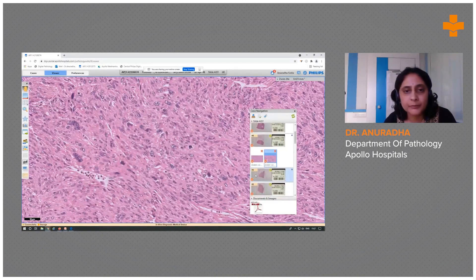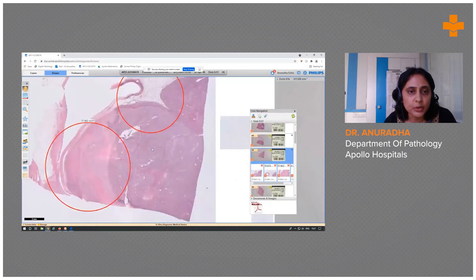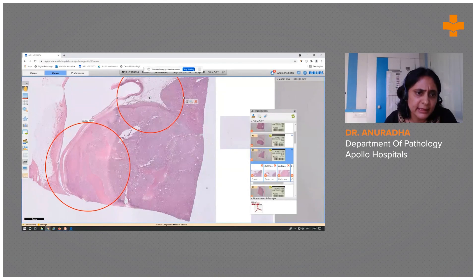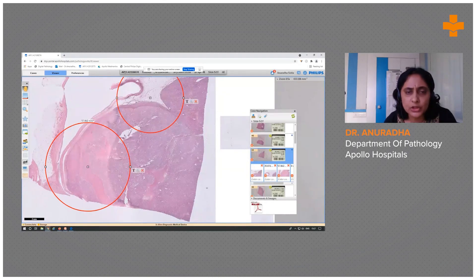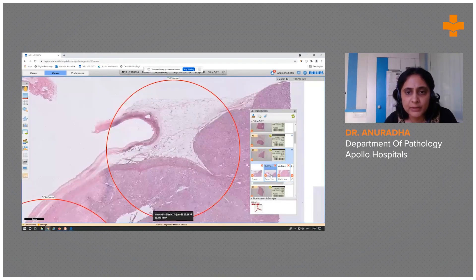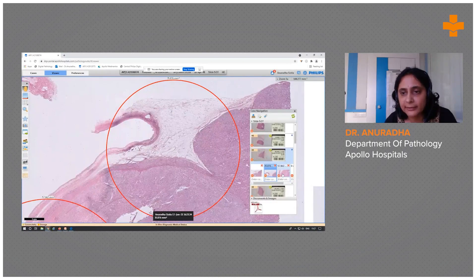This section was taken at the renal sinus area — this is the pelvis — and as you can see, the tumor is encroaching into the renal sinus fat. Here is a closer view showing the tumor encroaching the renal sinus fat along with areas of necrosis.